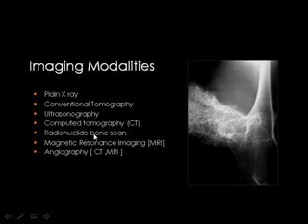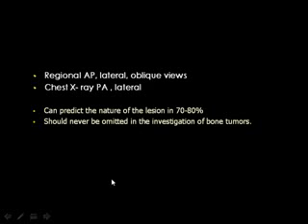These are the imaging modalities used for assessment of bone tumors, including the very important one, which is the plain X-ray. And we may still use conventional tomography, which is largely replaced by CT, ultrasound and bone scan, as well as MRI and the angiographic techniques.